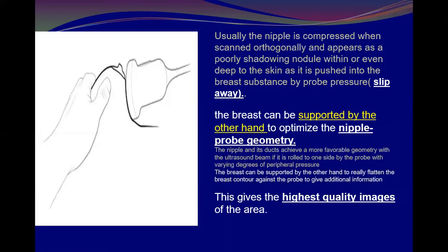Okay, another technique helping to visualize or to evaluate the nipple area is to support the nipple with the contralateral hand while you are pressing or pushing with the transducer, as seen in these illustrations here. As we mentioned, usually the nipple is compressed, pushed, or slips away.